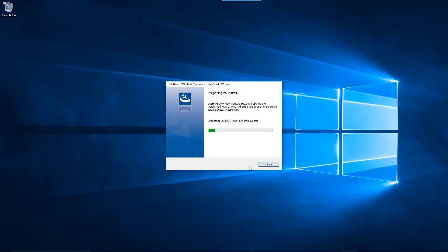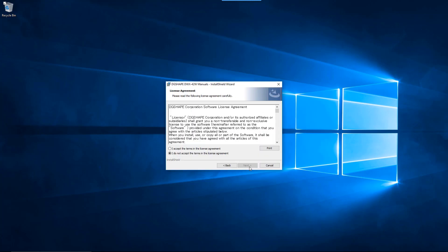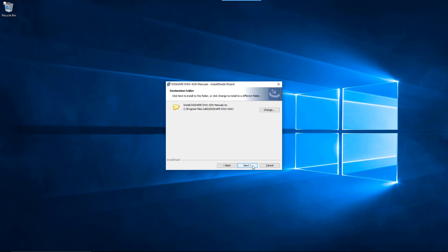When the InstallShield wizard is displayed, click the Next button to proceed. Review the Terms and Conditions. If you accept the Terms and Conditions, click on the I Accept button, then click the Next button to proceed.